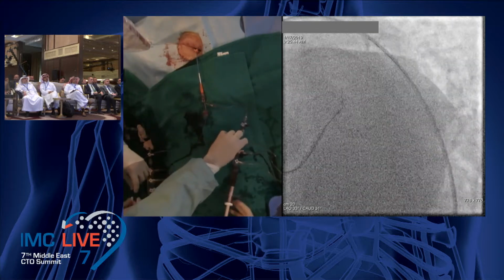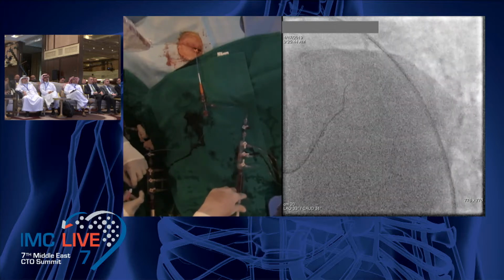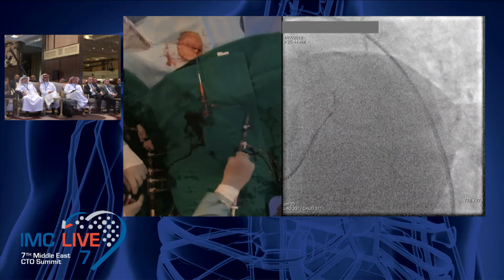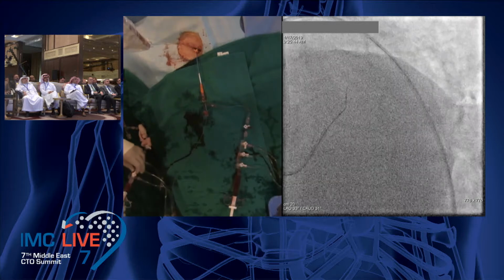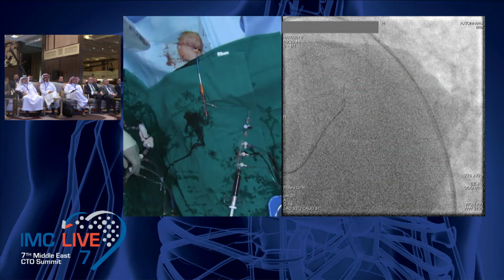We go retrograde maybe, no? So I think it's time to check retrograde. Okay, let's check here. Can you change the contrast? Okay, because I have a lot of air.